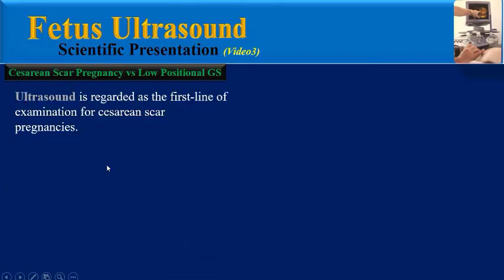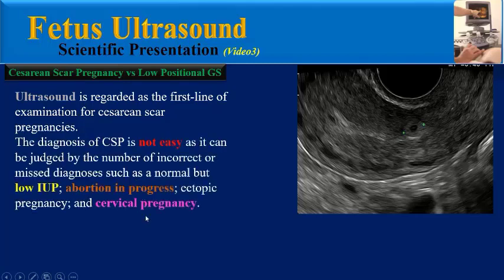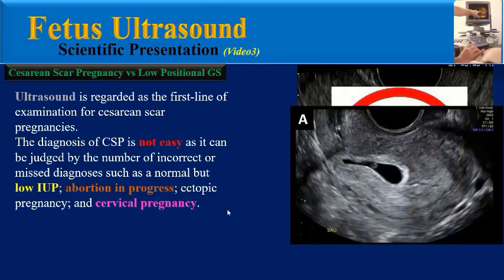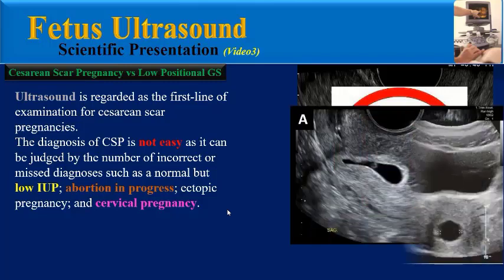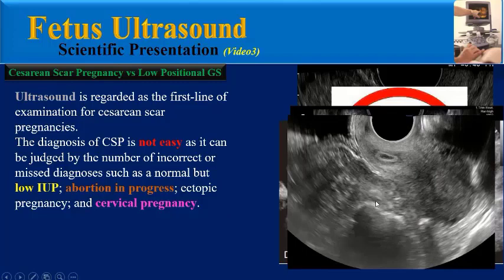Ultrasound is regarded as the first line of examination for caesarean scar pregnancies. The diagnosis of CSP is not easy as it can be confused with a number of other conditions, such as a normal but low intrauterine product, abortion in progress, ectopic pregnancy, and cervical pregnancy.